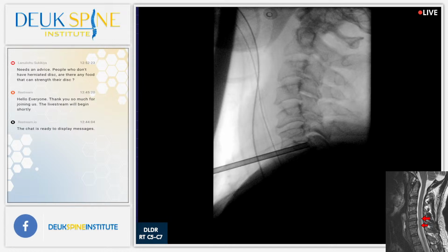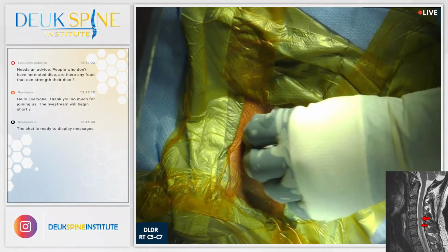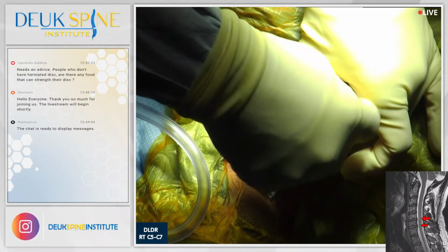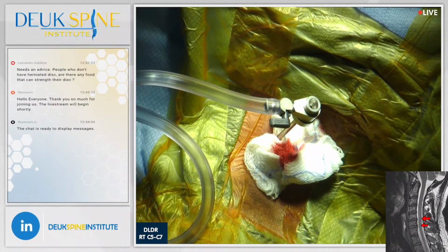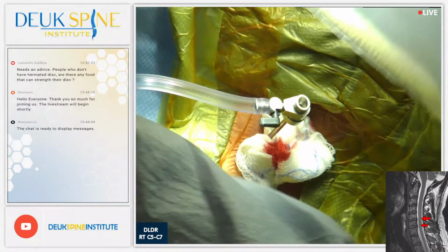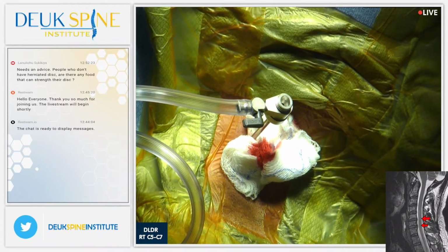Now take a look at this, folks. We have a 4mm incision. We've lost 2 drops of blood, and we're going to fix these 2 discs with this tiny little incision. We're using an endoscope to do that, and an endoscope lets me see what's happening inside this patient's disc. The good news is because it's a high definition, high powered endoscope, I can see very great detail.